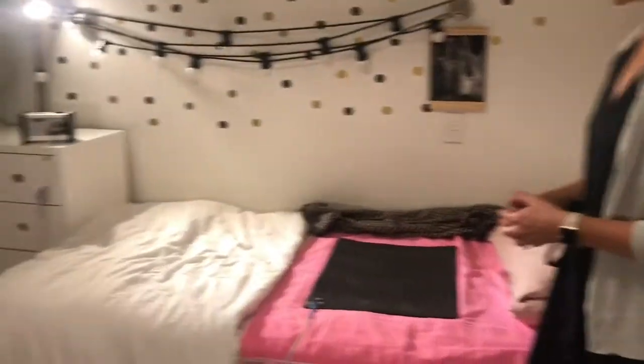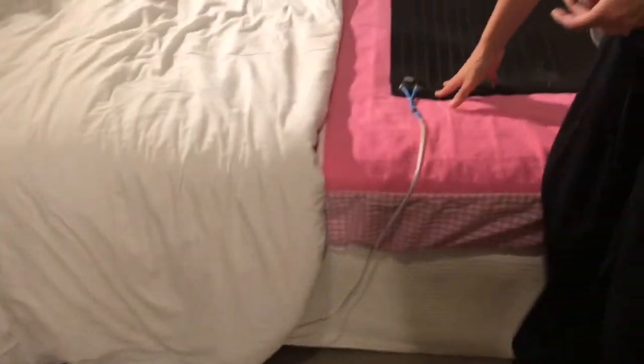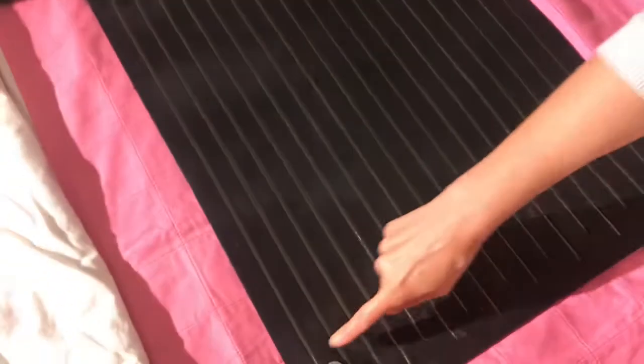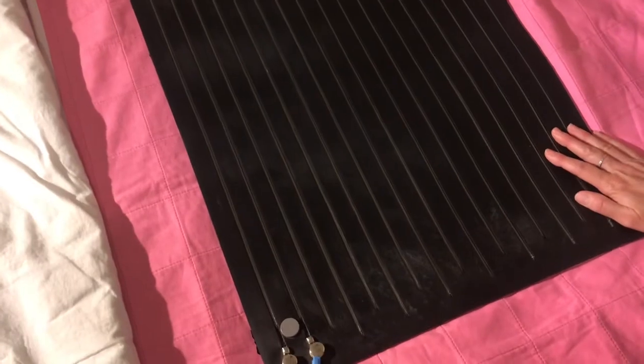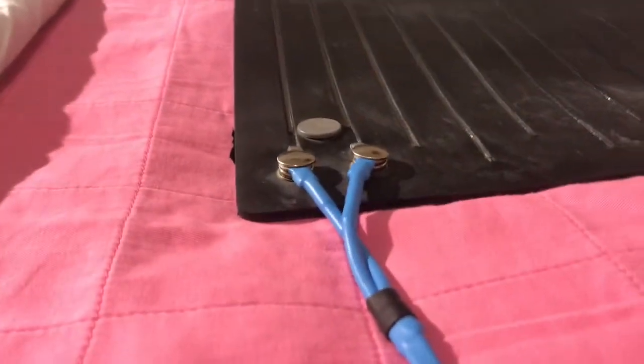I've set up the alarm system. I've got the alarm unit over here and then the cord attaching it to the bed pad. Taking a closer look at the bed pad, it's basically lots of wire sensors rebated into a rubber pad. And this is the cord which attaches to the alarm unit.